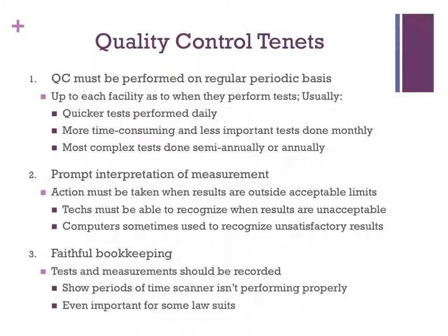Some programs even have the techs enter the measurement data for QC tests into the computer, which then does the recognizing to see if the measured data is outside the acceptance limits. But if this is the case, then the tech must enter the data into the computer right away and not wait a certain amount of time and collect a bunch of data and then enter it all at once.